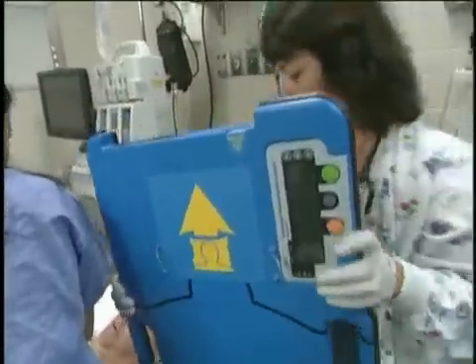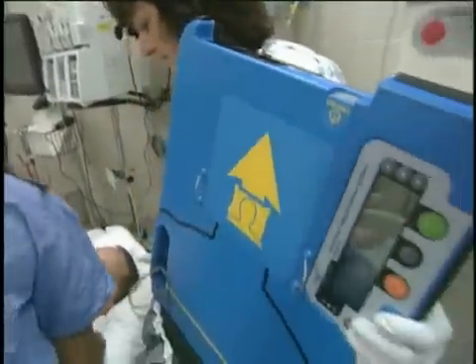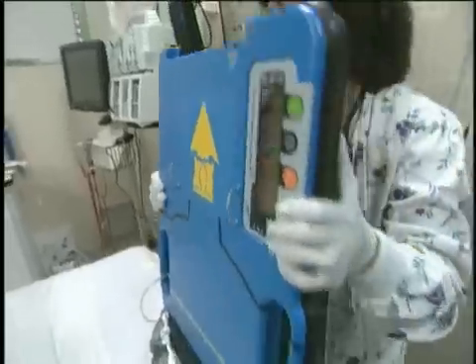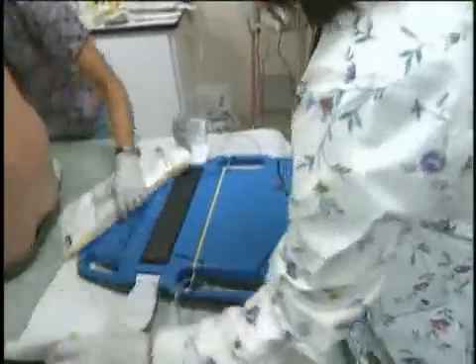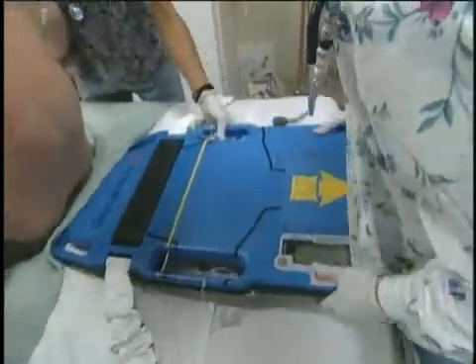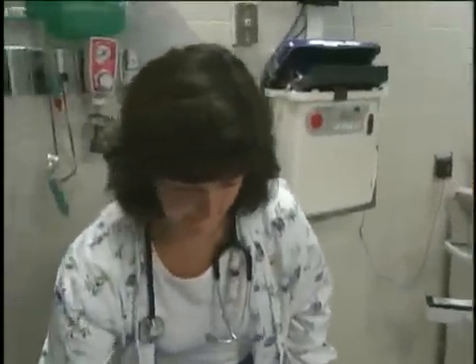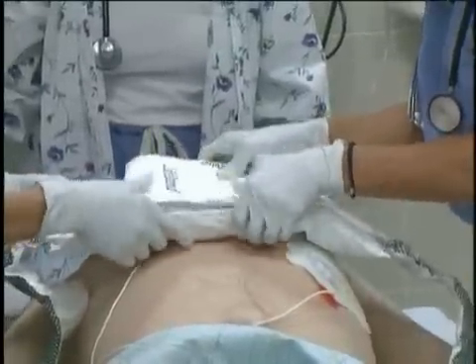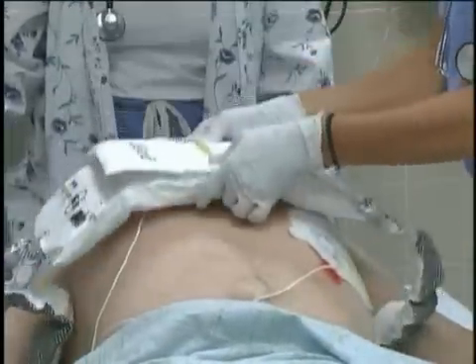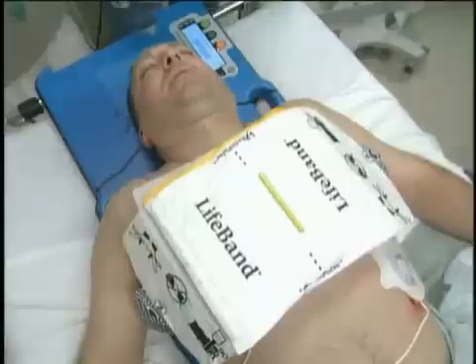Auto pulse ready. Are you ready? Let's lift. One, two, three. Starting auto pulse.